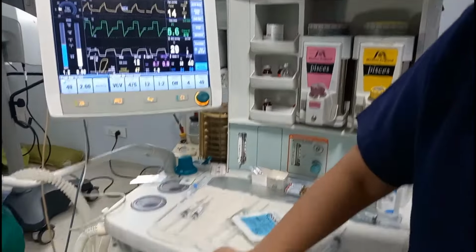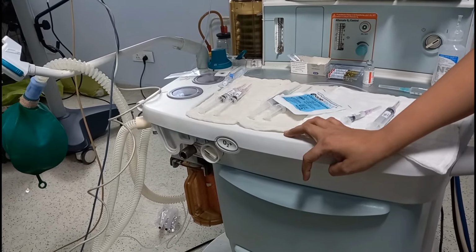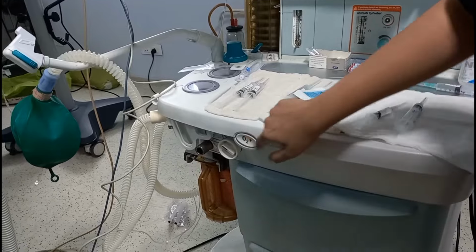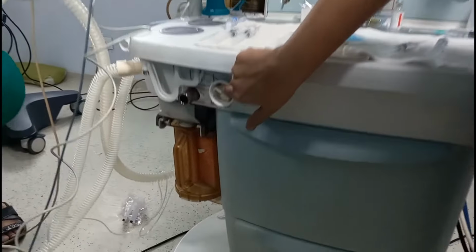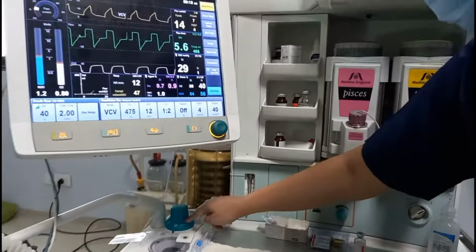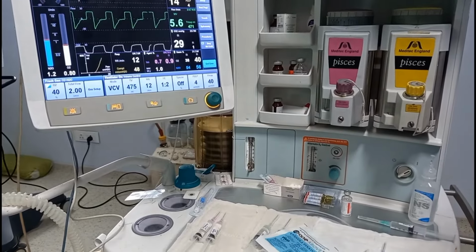This is the oxygen flush valve, as we had discussed. Oxygen flush valve is a part of intermediate pressure system, has a flow of 35 to 75 liter per minute. This is the oxygen flush valve for these modern machines, and this is the common gas outlet. This is the circuit which is for turning this machine into open and close type. And this APL valve also has a part where we can hand ventilate the patient and machine ventilate the patient. So this circuit is for hand and machine ventilation.